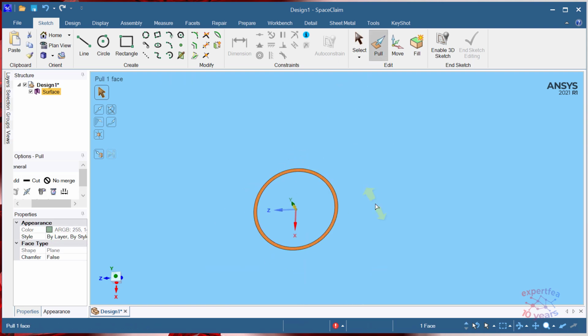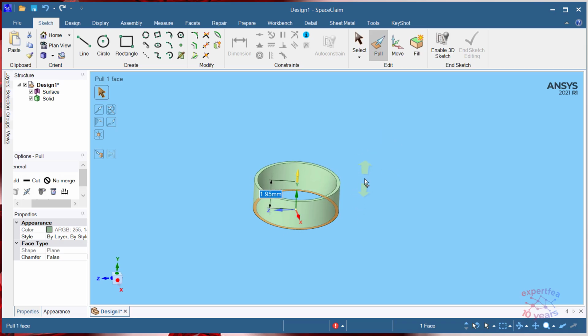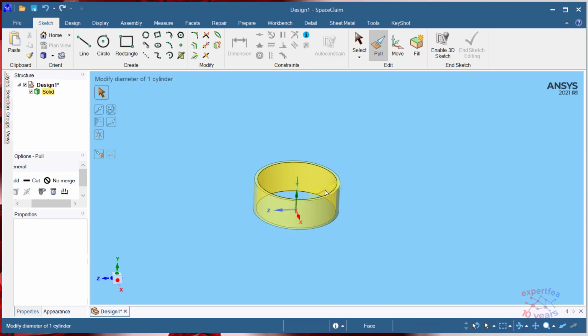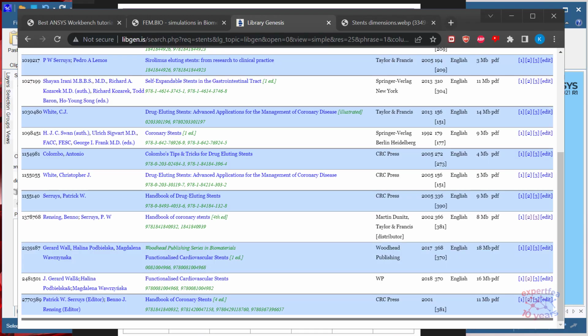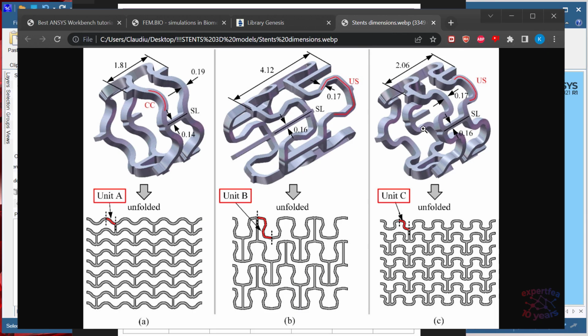Let's pull this face a little, and we will go for a 2 mm portion this time. Of course I will not do such complex geometry today, but I want you to see some inside thicknesses of the struts. So they range between 0.1 something and 0.192, yes, 0.14, 0.19.